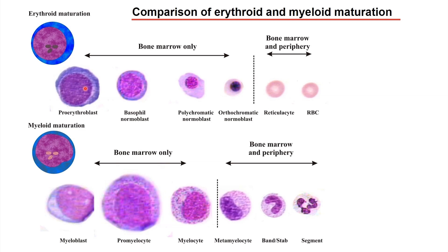When you are looking at the proerythroblast, the first stage that can be distinguished by light microscope, we do see that the edge of the nucleus is very finely differentiated from the cytoplasm, because we do have a very light or wider perinuclear area surrounding it. Next, when the chromatin structure of the proerythroblast is getting a little bit dense, you do see some dark patches inside the chromatin structure, and the cells are a little bit smaller. The size of the erythroid proerythroblast is about 20–22 micrometers, while the basophilic normoblast is about 2 micrometers less.